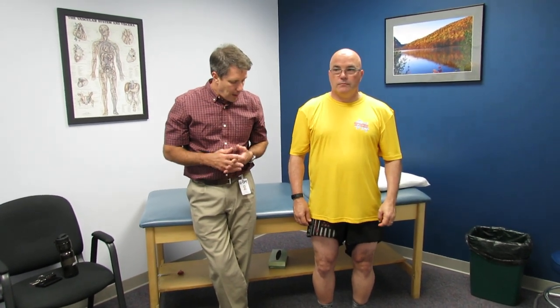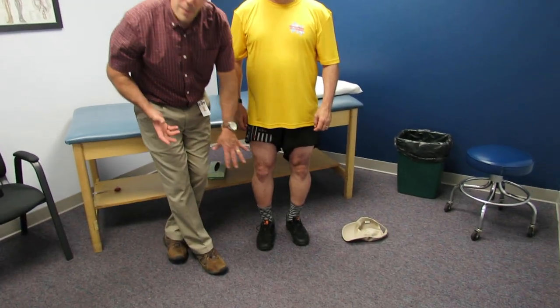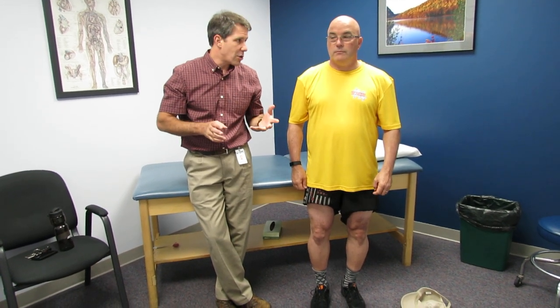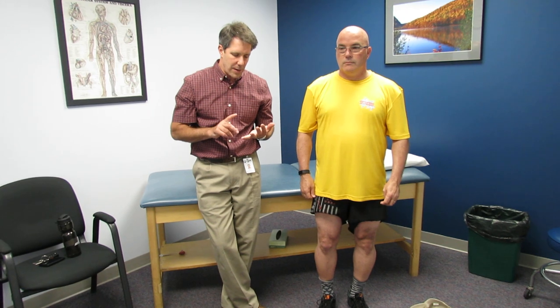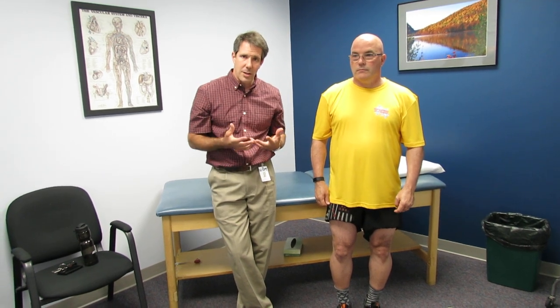He should know right away if he's feeling good or not. Another thing that makes him a good candidate for a brace like this is the shape of his leg is not too conical — it's nice and straight, so the brace should stay on really well. You just don't put an offloader brace on everybody; they really should be the right candidate. They should have gone through physical therapy, become strong and flexible, and have good extension.